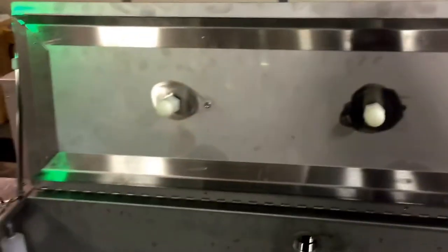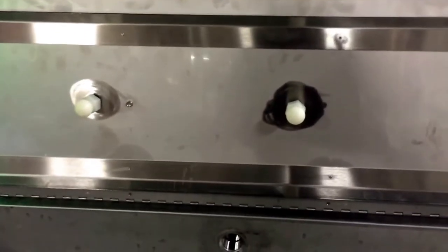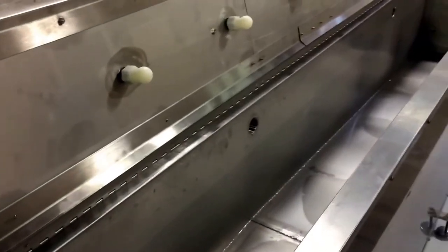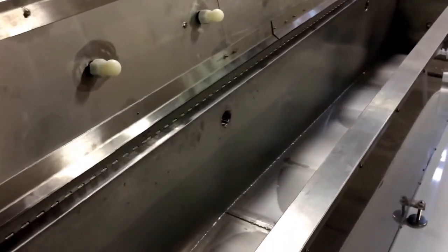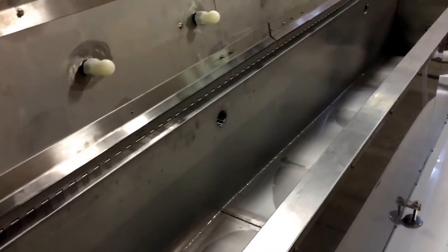Once the ultrasonic step is done, spray heads on top will spray all the parts, the walls, and the tank down, flushing to drain so there is no drag-out from step to step. It then proceeds to the next solution, with two ultrasonic DI rinses at the end that can cascade overflow down the drain if conductivity requirements are not met.